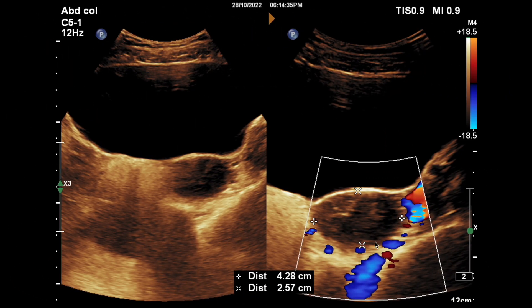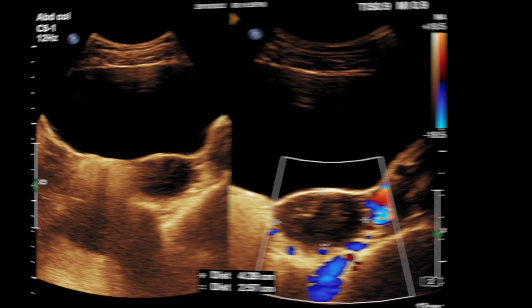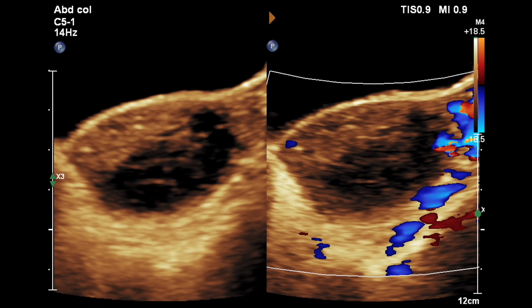Here is a two-dimensional measurement of the left ovary. On color Doppler, there is no vascularity within these septations. This is important to exclude other lesions like malignancy. The surrounding normal ovarian parenchymal vasculature may be seen.